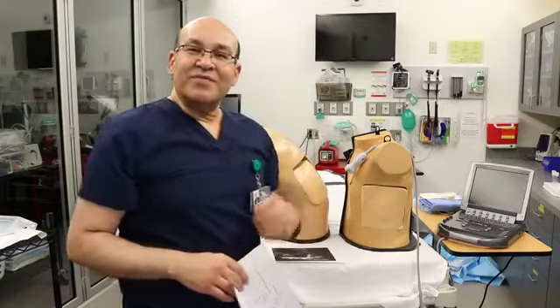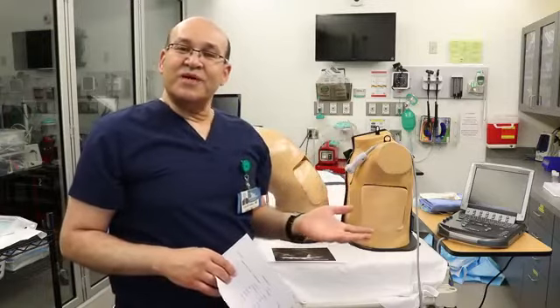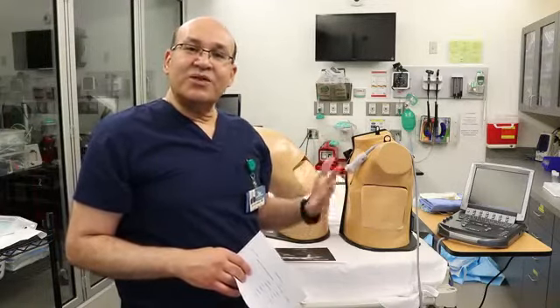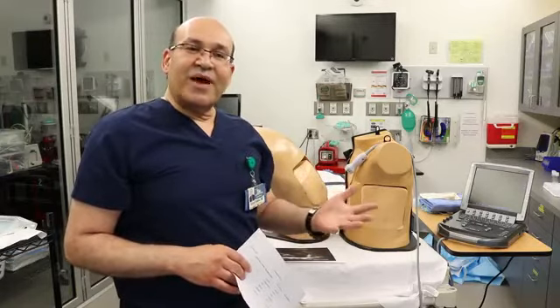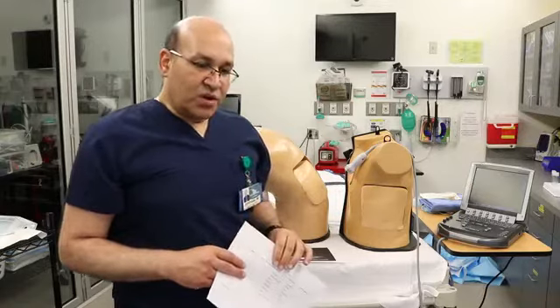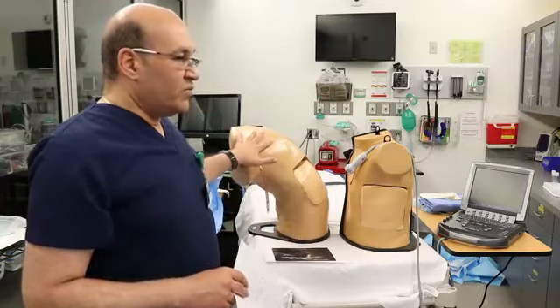I usually ask them if they want to go to the bathroom before you do the procedure, so patient doesn't feel the urge with the stress of the procedure that they want to go to the bathroom in the middle of the procedure. So this is one important thing. So this is the position that we do the thoracentesis.